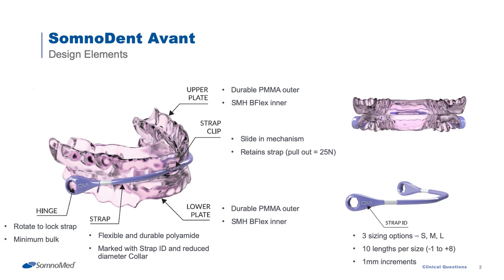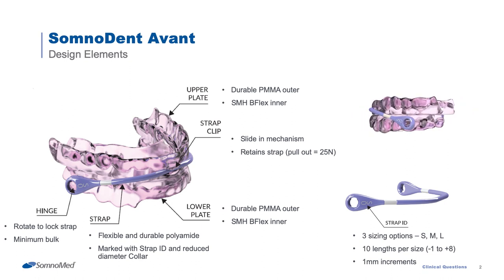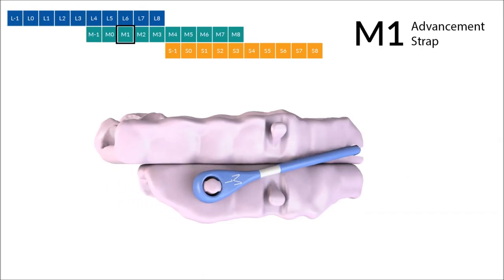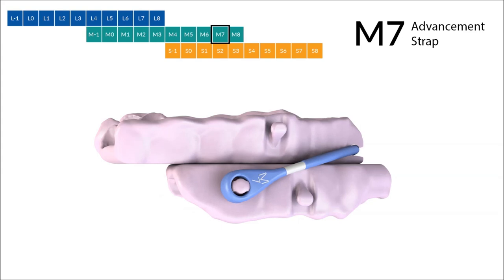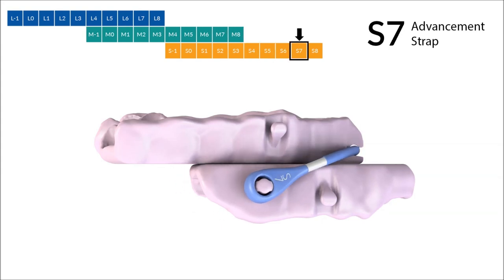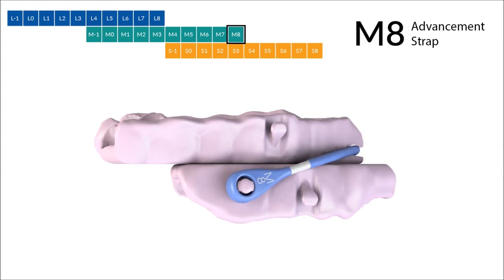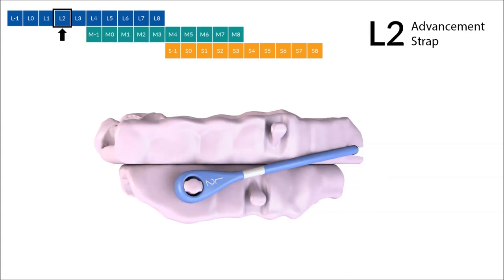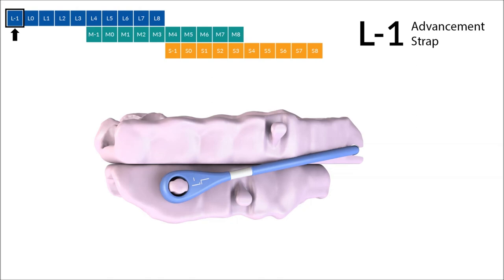Each strap is marked with an identifier for its size. SomnoDent Avant's novel advancement mechanism involves the interchange of different length straps to provide protrusion. Higher number straps advance the mandible, and lower number straps provide retrusion of the mandible.